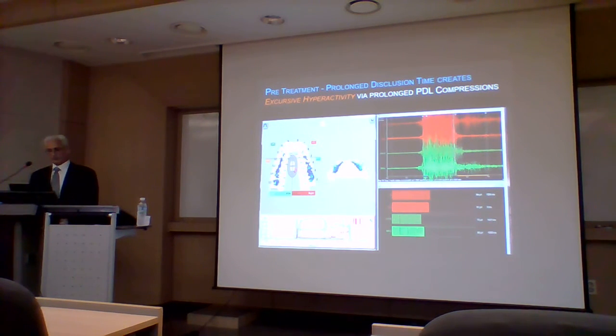So if we watch this play, now she's sliding to the right, and her center of force goes directly into her molars. She has a group function, which you can see on the T-scan data. And the EMG, she's firing these muscles very high. And they only start to go down as she gets closer to the anterior guidance taking over. You see they reach their lowest level when the anterior guidance takes over.